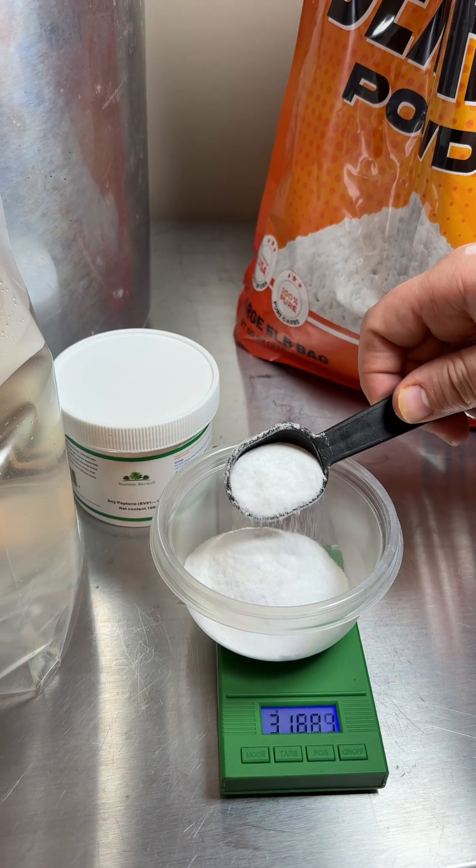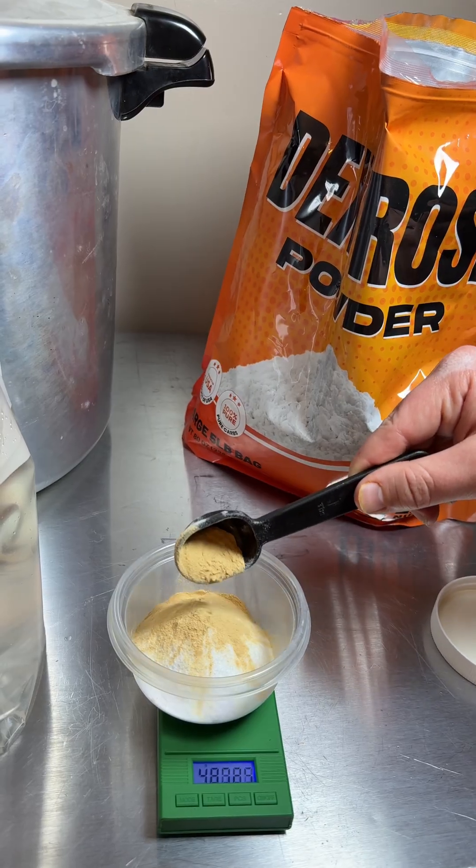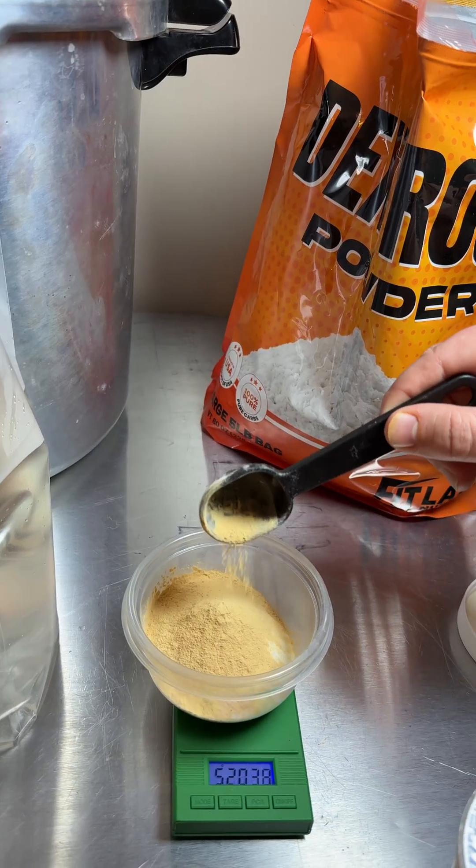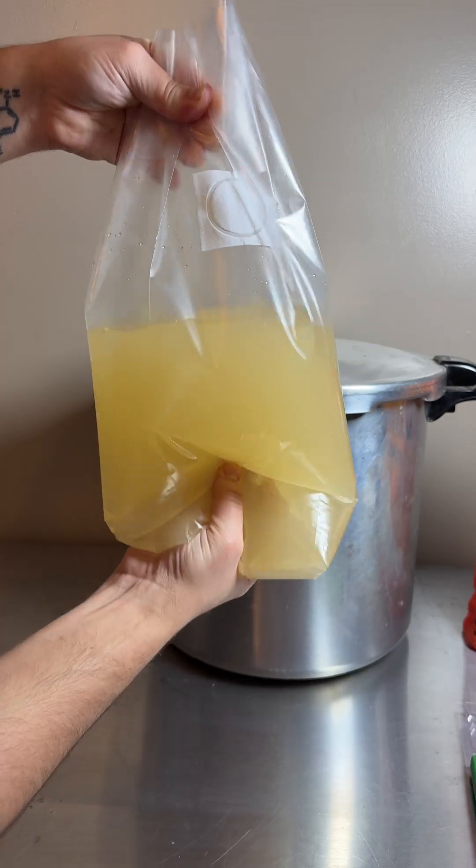First, I added 2,400 milliliters of warm water to the filter patch bag, and then I weighed out 48 grams of dextrose powder and 4 grams of soy peptone powder and added that to the filter patch bag.